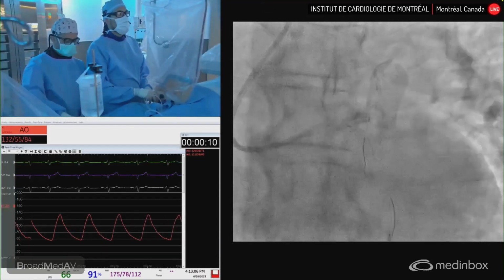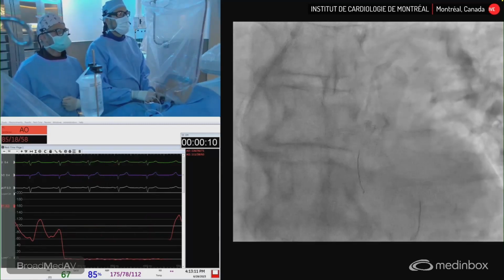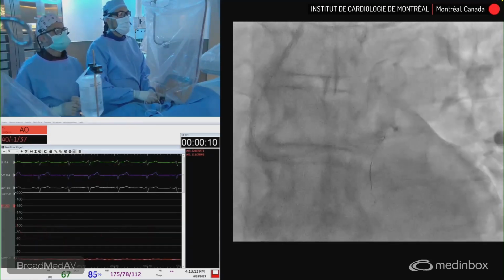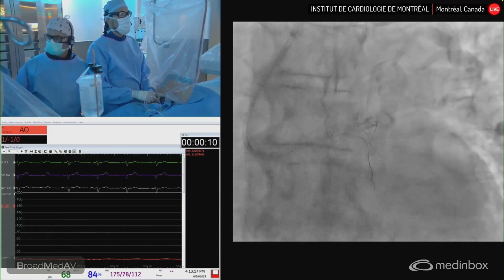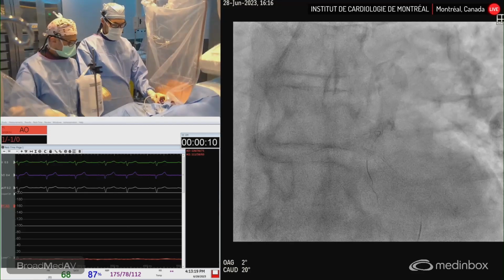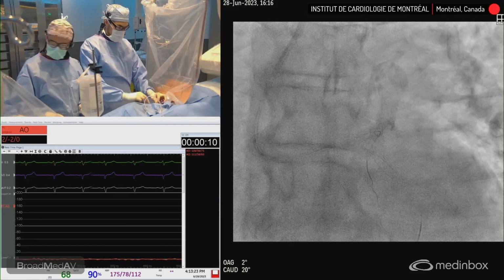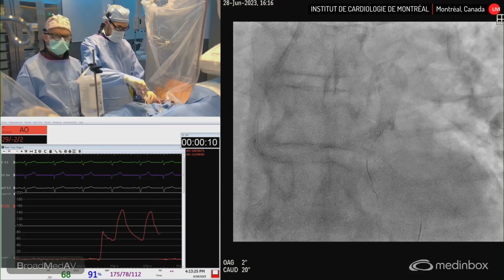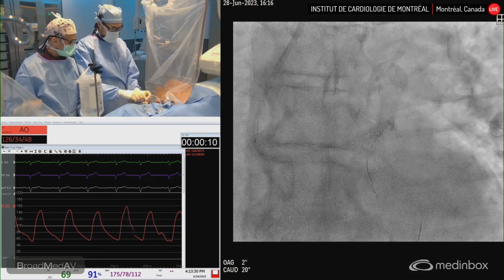Remove this. The pain will go away, my dear sir. You prepare the IVUS now. IVUS, and then I would only do one view if the IVUS is good. Oh yeah, minimize the dye. All right. Oh, my God. Okay, that's good. Guys. Good.